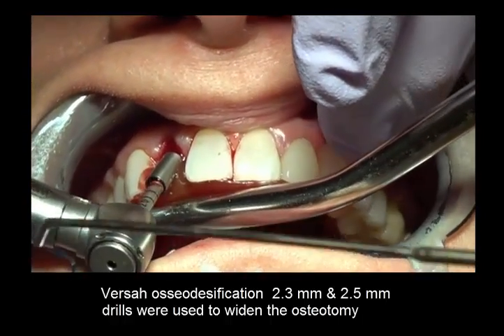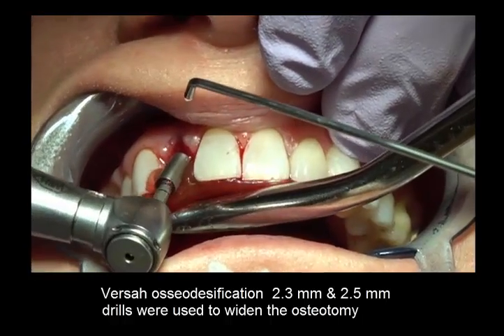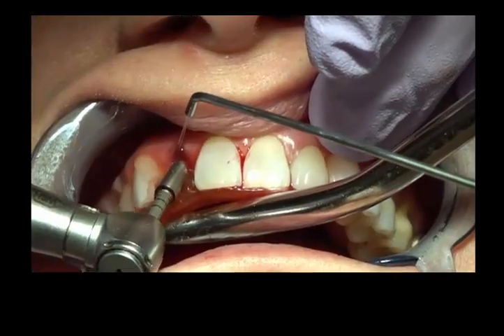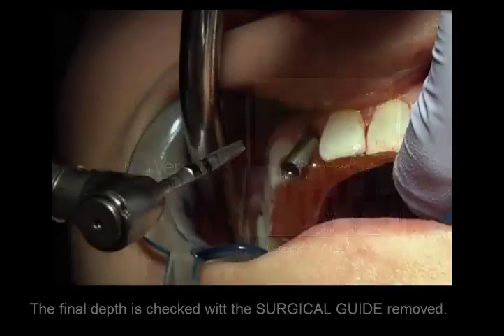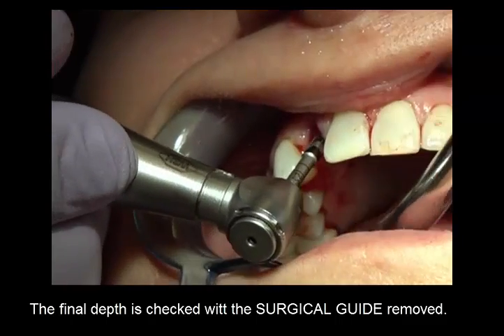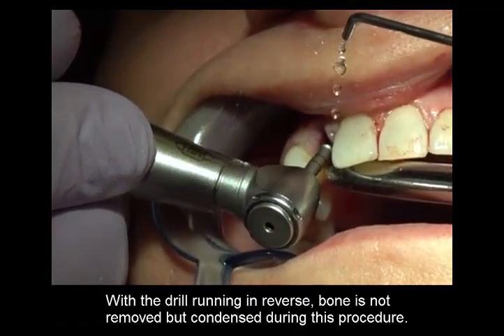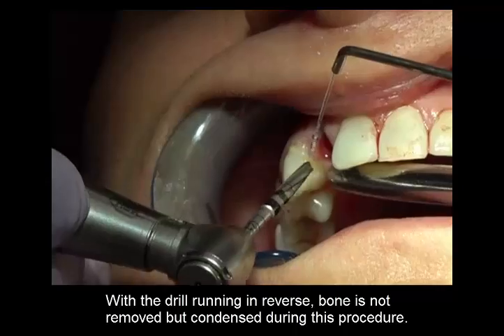The osteotomy was widened using 2.3 and 2.5 millimeter drills within the 3 millimeter guide sleeve. The depth of the osteotomy is checked with the surgical guide removed. While the drill is running in reverse, the bone is not removed but condensed during this procedure.